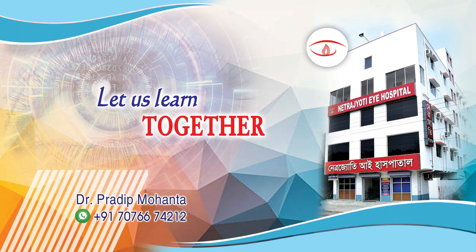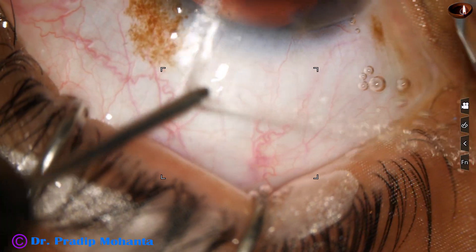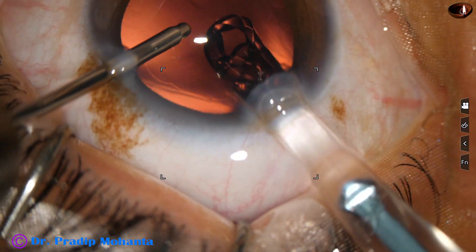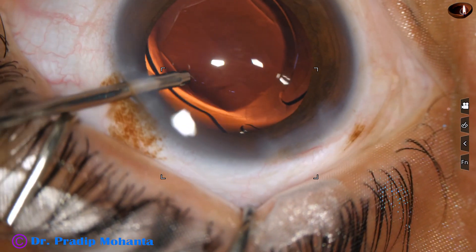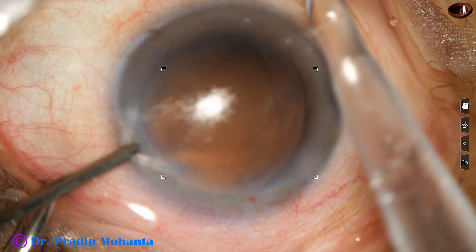Some hydrophilic acrylic material opens gently and some does so abruptly as it is implanted in the capsular bag. Let us see this one — as it goes, the lens opens gently. It is easy to handle these lenses.